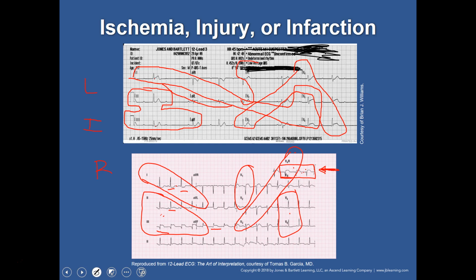I use this way up here because I find it easy, because once your mind is a little distorted and you know what you're looking for, that looks like an L. That's an I and an S and an A. Once you become a lot more accustomed to looking at this and remembering what lateral and inferior and all of that is, it's not going to matter anyway. So you just figure out what works for you, and you carry on and do some good 12-lead EKG interpretation.